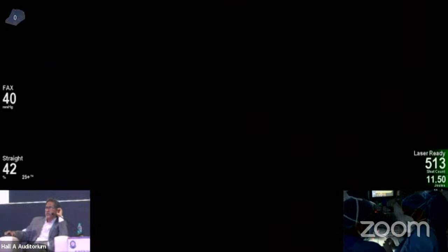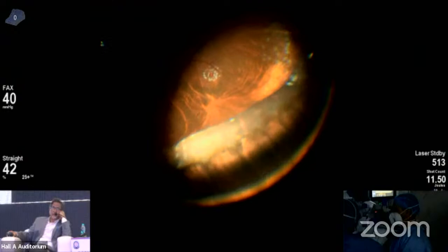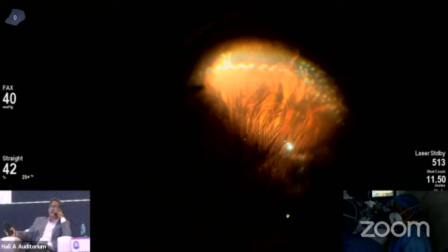We'll just go on to check the periphery. Can you give me periphery? The periphery must be checked in these cases, because sometimes you can't detect a tear, and later on you identify it. So this is something again which is a must in all cases of vitrectomy. You thoroughly check the peripheral retina so that you do not miss any tears. So if you see, this is a very peripheral tear right at the ora serrata, and I have done 4-5 rows. So it is almost like a GRT, and you can see there are no other peripheral tears. We have checked the temporal half.